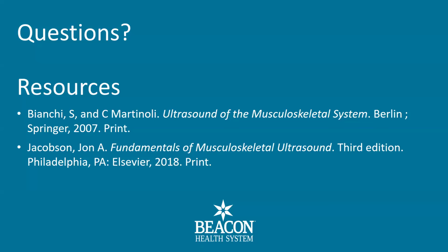There was an interesting article that came out saying that this is underdiagnosed in people with osteoarthrosis, and that hasn't been my experience. I throw that out to anybody else on what's their experience, because rarely do I see an actual Pes Anserine abnormality.